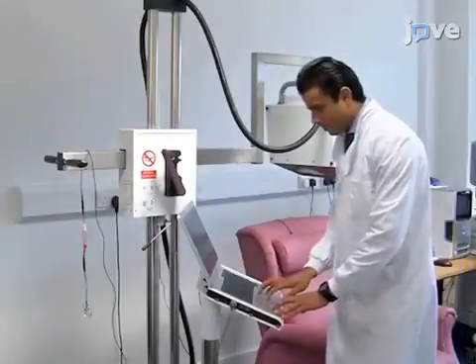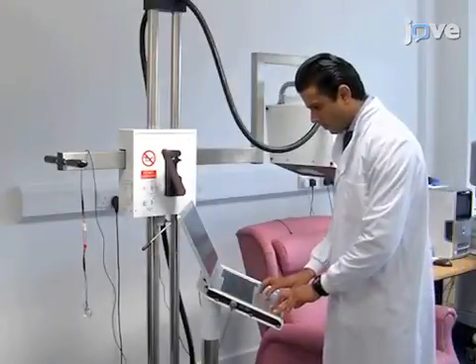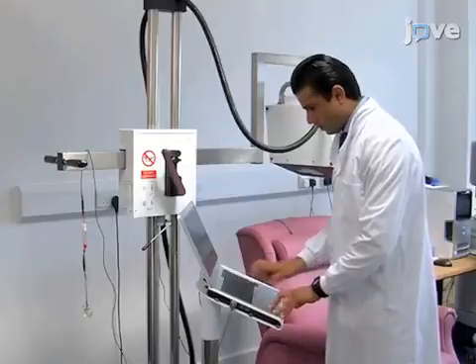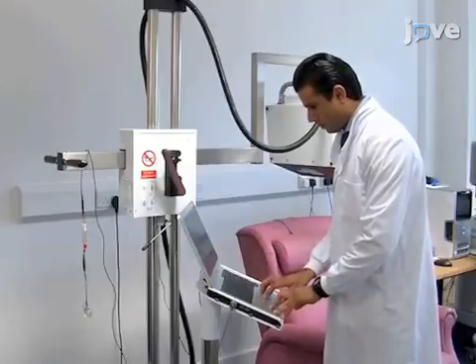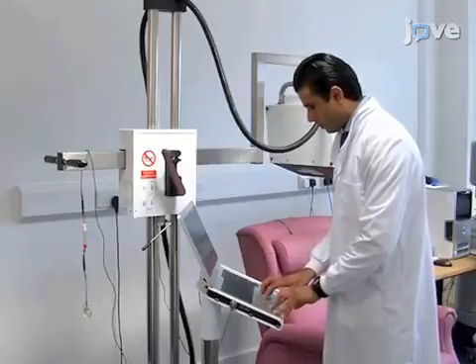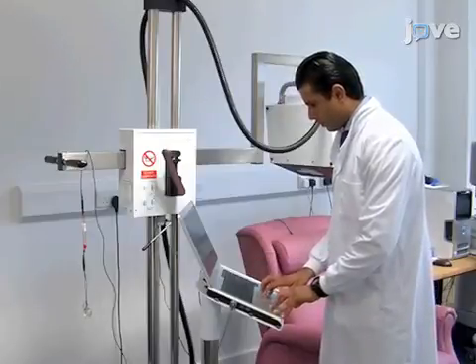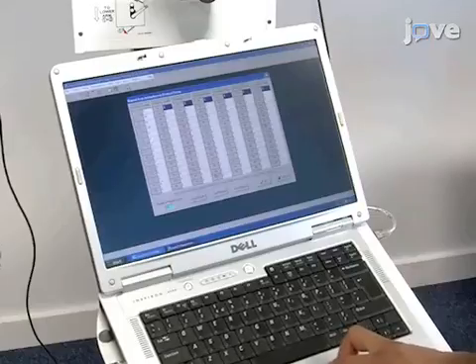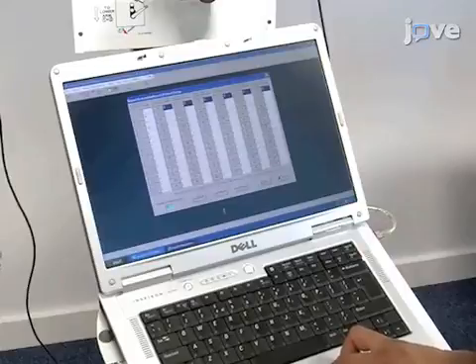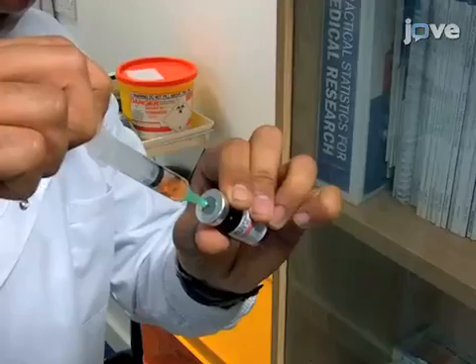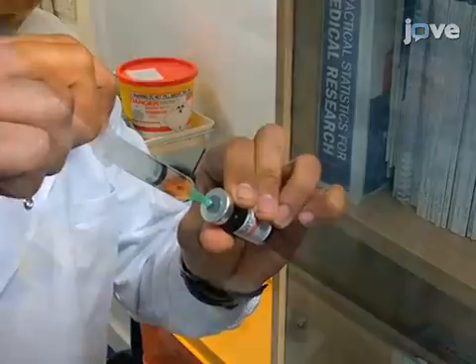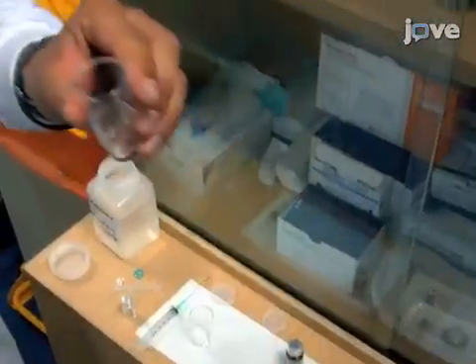First, prepare the laser Doppler imager. Let it warm up for half an hour or longer. Calibrate the machine and get the software ready to use. Also, prepare the solutions in the perspex chamber.